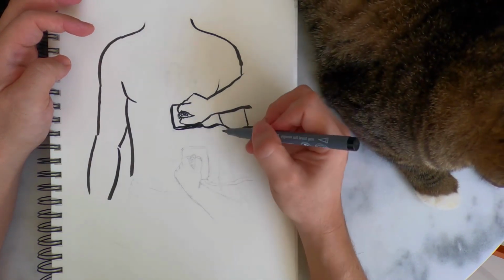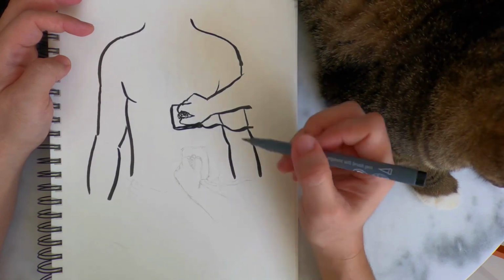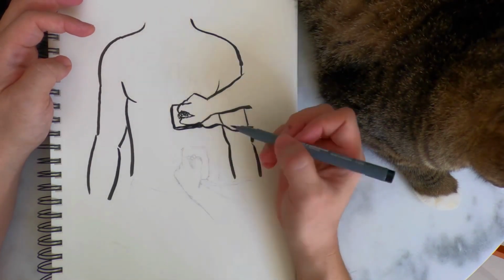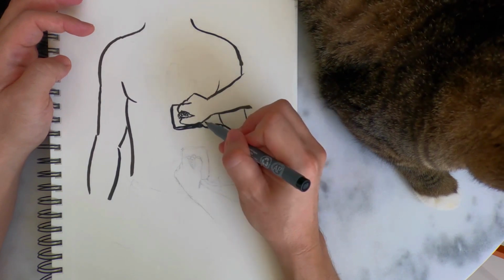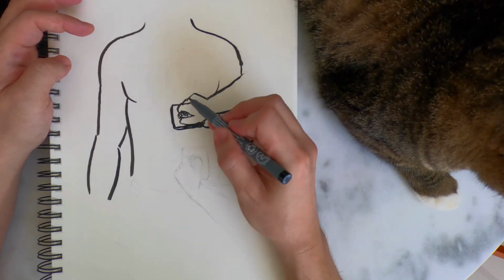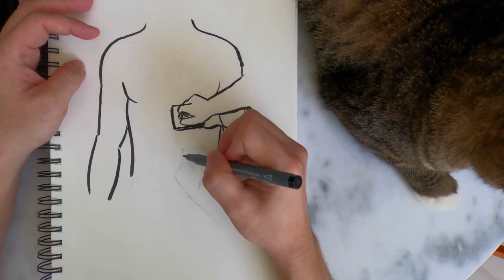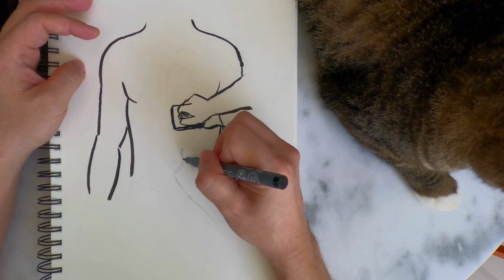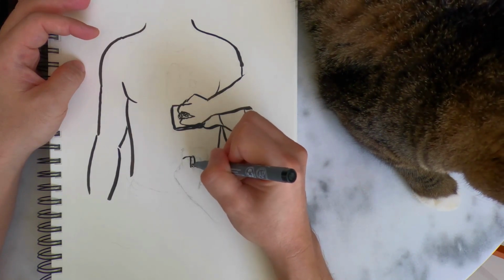The treatment involves performing CPR, which is correct, and we also need to use defibrillation to reset the heart rhythm back to normal. The placement of the pads is also important. In this image, I believe the first pad on the left side is placed under the left nipple, which is the correct position. This position is labeled as apex. The other pad is located at the upper right position, right.